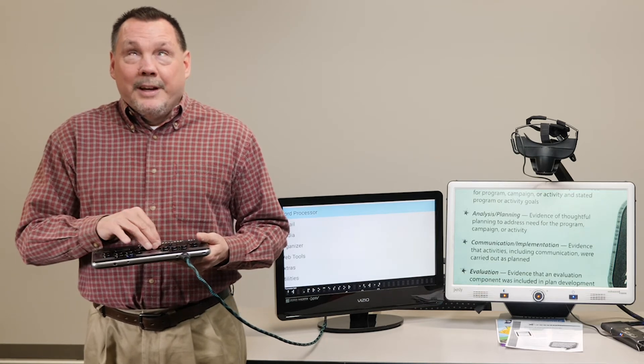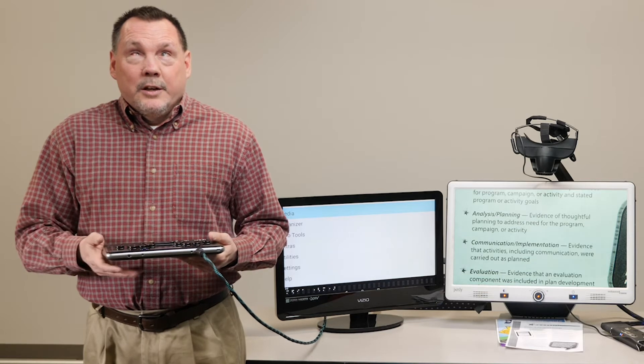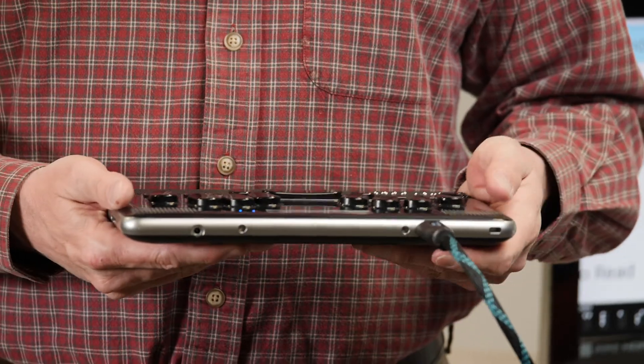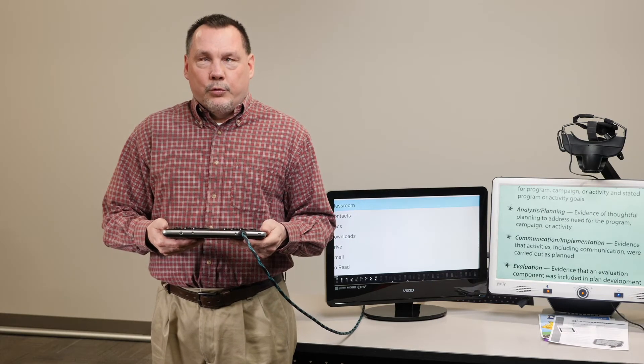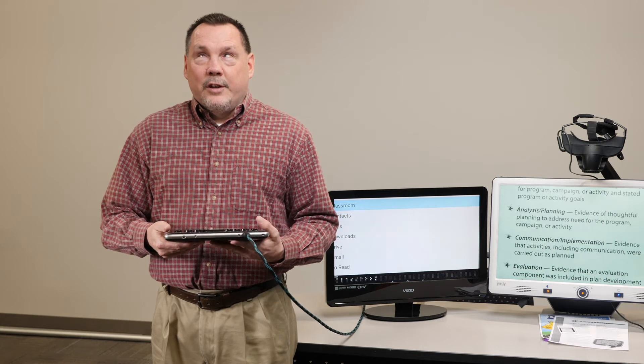What you're looking at right now is the main menu. It has everything from the top: file manager, word processor, email client, and media — all standard things you would be used to seeing on a note taker. Here's where we cross over from what you'd expect out of a traditional note taker to what makes this device so appealing. We have the Play Store here, which is Google's version of the app store, so you can download hundreds of apps useful to you. This device is also accessible with Google Classroom, and it works very well.